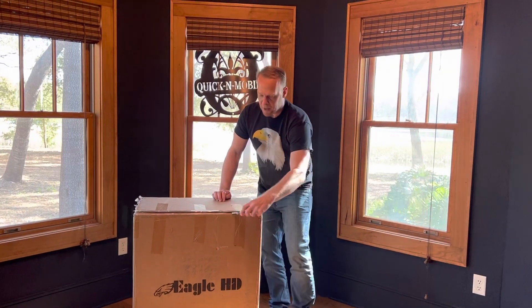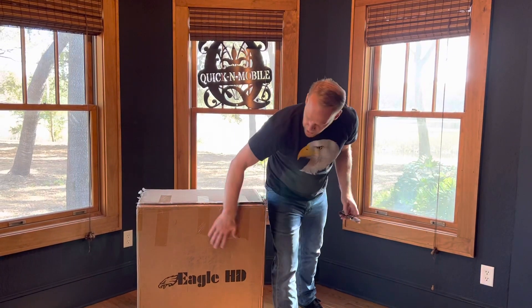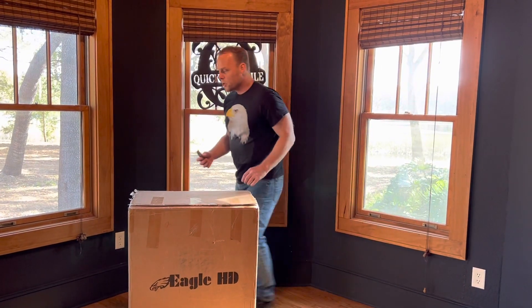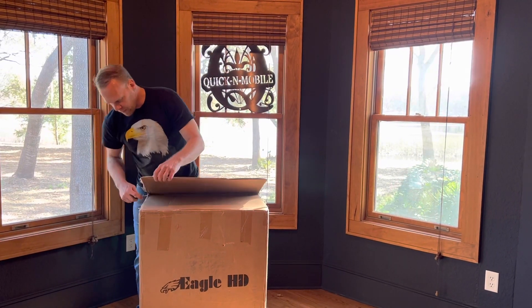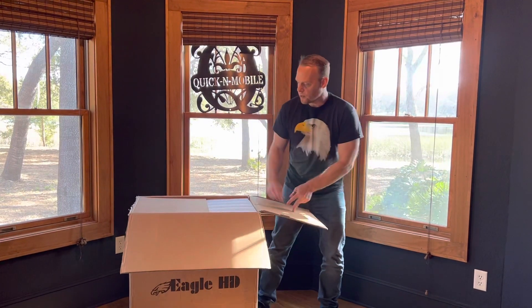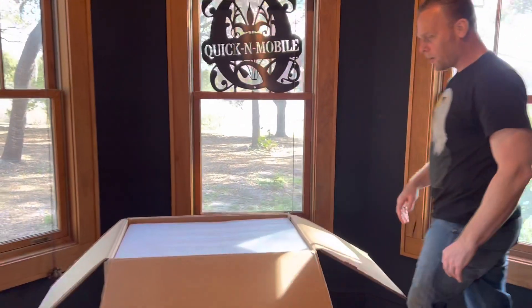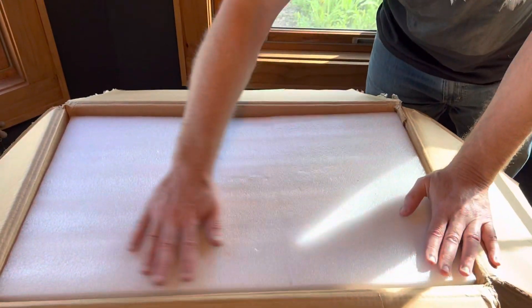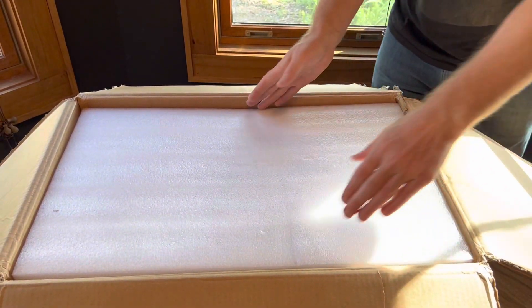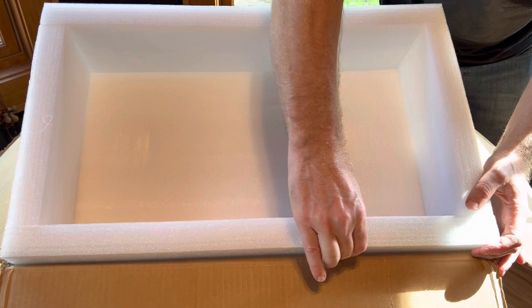A lot of the time unboxing, you can kind of see the box itself is designed to take a little bit of a beating in the shipping process, and sometimes they do. When we open this, first thing I want to show you is really the packaging material. This is the first sight you're going to see when you open the Eagle, and when I take this packaging material off, you're going to see that this is a substantial packaging material for your Eagle Power Folding Wheelchair.